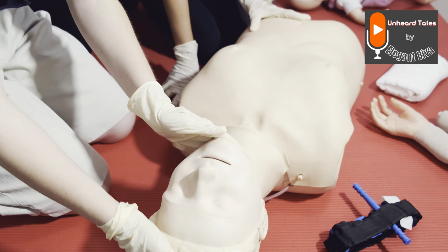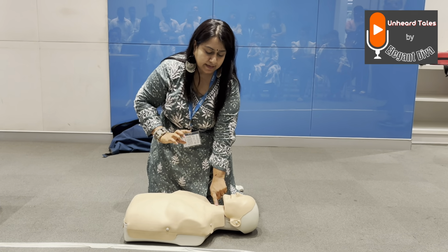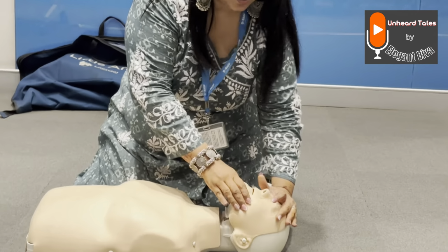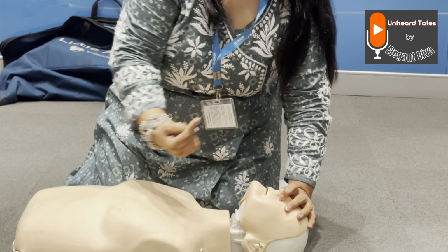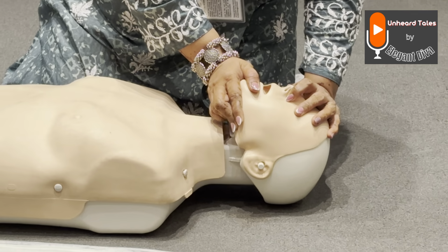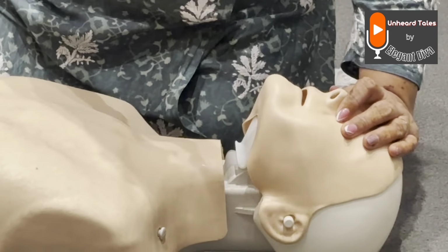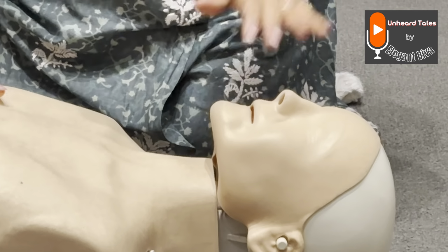Now here, this thing is tilted, so you have to straighten it. Right? So what you do is you straighten it. You close the person's nose, because you give it through the mouth, it should not come out through the nose, right? You lower the person's lower jaw, breathe, form a tight seal and put the air inside. Breathe out in his mouth, 2 times. Okay, 30 compressions and 2 breaths.